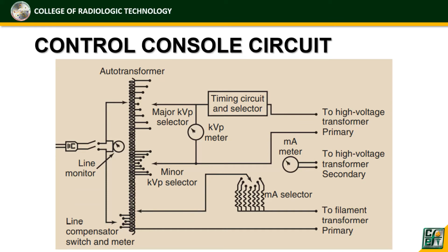Now let us view the control console circuit. So what are those things that are included in the control console circuit or the low voltage circuit? As you can see here, this is the power source.